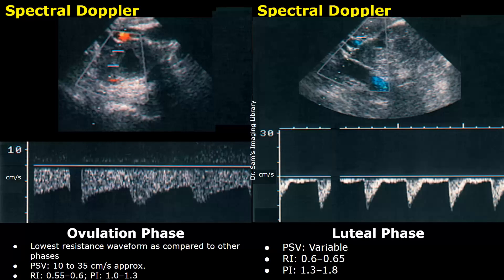As we enter the luteal phase, the resistance starts to increase. As the luteal phase progresses, the resistance continues to increase. We may find sharp peaks in the waveform. The PSV can be variable in this phase, and the value of the resistive index is increasing.